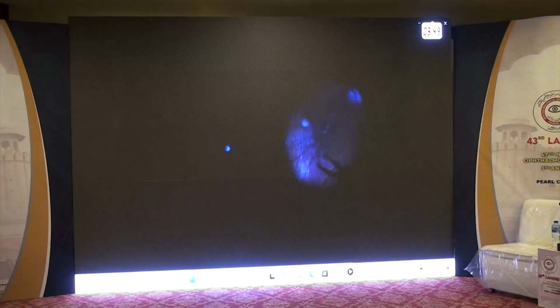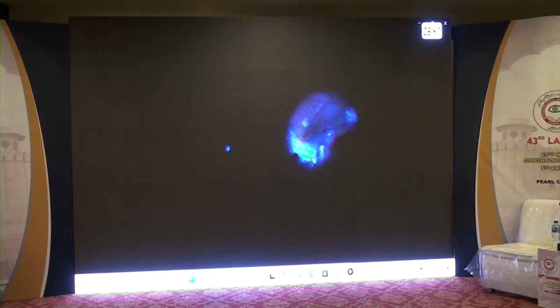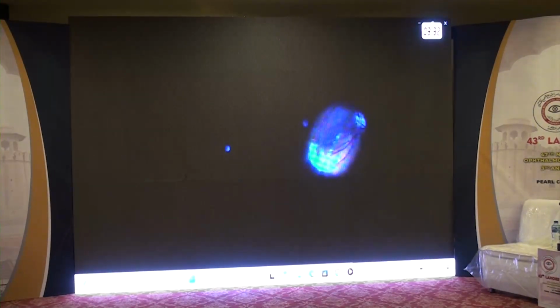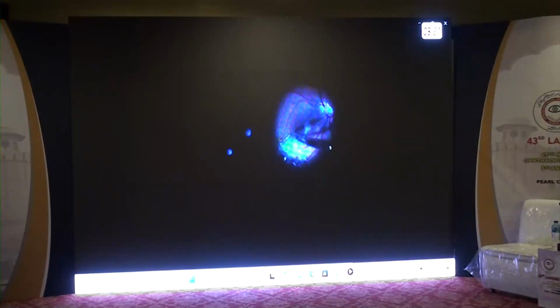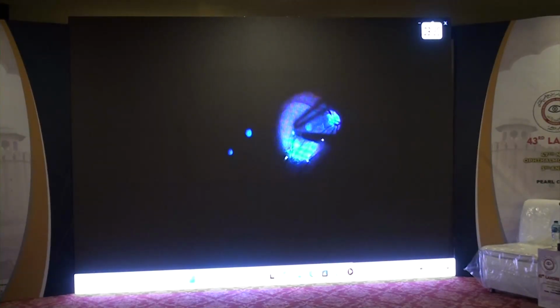Just think that you are performing a continuous curvilinear capsulorhexis. You have to observe the underlying retina while performing an epiretinal membrane peel to make sure that the shear stress induced on the retina is not so much that it causes an iatrogenic break.